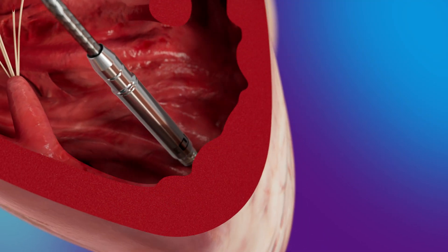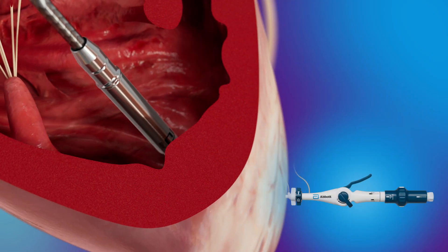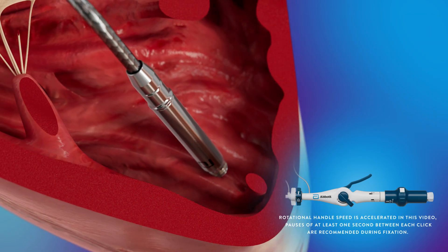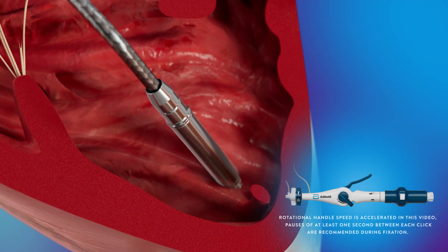Initial capture threshold, R waves, and impedance measurements are performed. If satisfactory measurements are confirmed, fixation begins. The device is rotated one and a half turns to fully fixate it. The device contains a radiopaque chevron that can be seen under fluoroscopy and is used to assess the rotation of the leadless pacemaker.